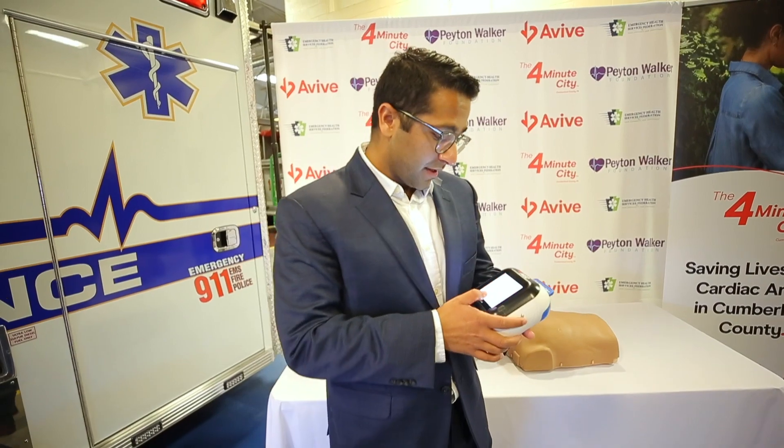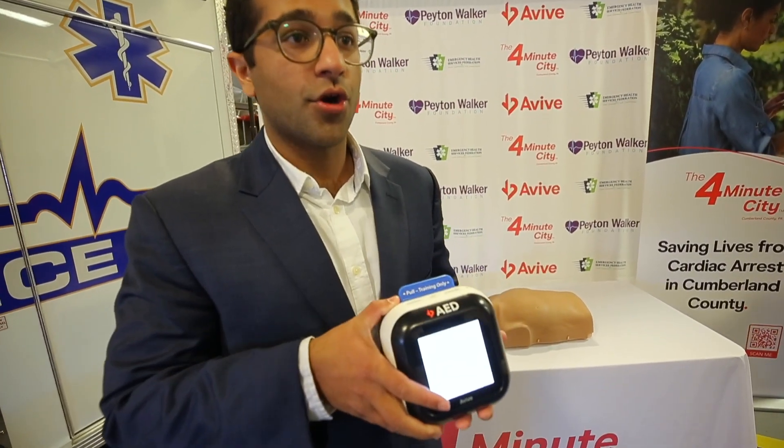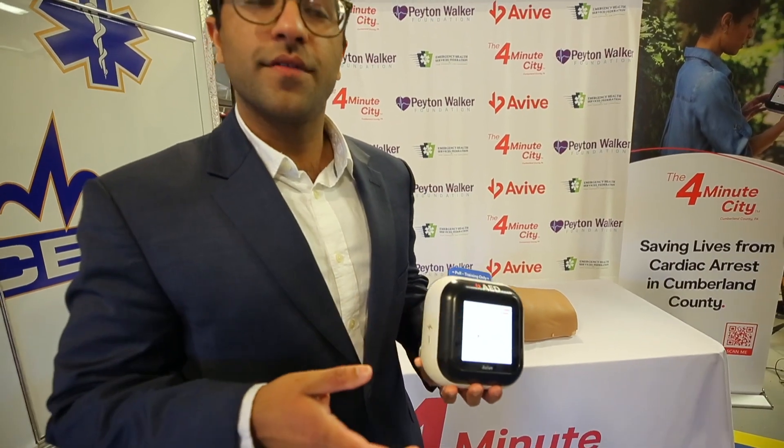This red alert on any nearby AEDs would show up, and if someone were to accept the alert — say it's in your car, your home, or at a restaurant and you happen to hear the alert go off — you accept it and you'd have Google Maps taking you from your current location to the location of the patient.